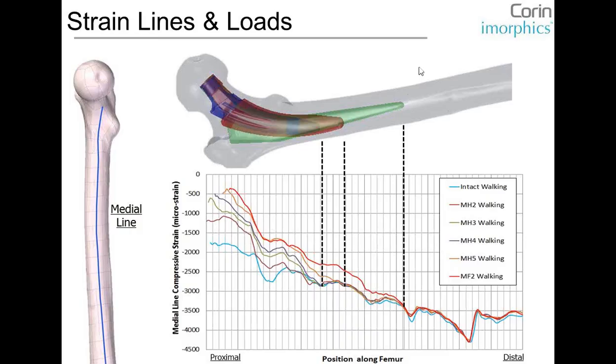This illustrates that in the study we found that surgeon response, or surgeon positioning of the implant, is very important to ensure that there is good take-up of the implant and no long-term aseptic loosening or bone remodeling.